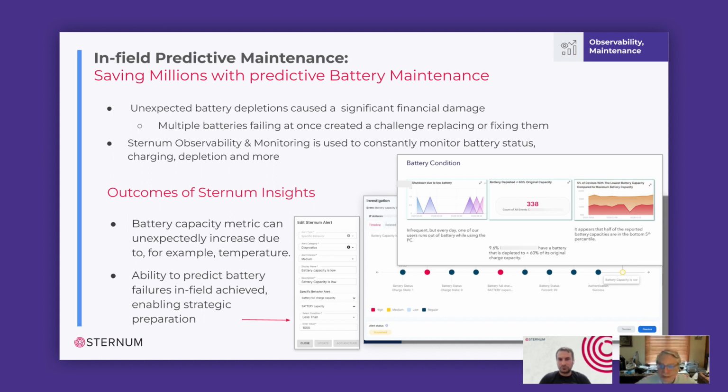Right. This may not sound like a particularly major issue to people, but as an example, we have some home monitors where one of the components in the home monitor has a rechargeable battery. And if you know anything about rechargeable batteries, they have a lifespan. And the more often you recharge them, the less the full charge capacity you get. And eventually, over time, their capacity is so compromised that the system really can't hold a charge for a reasonable amount of time. So we have one product in the field that there's millions of these.